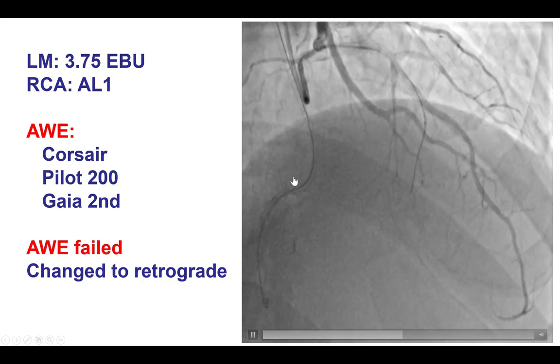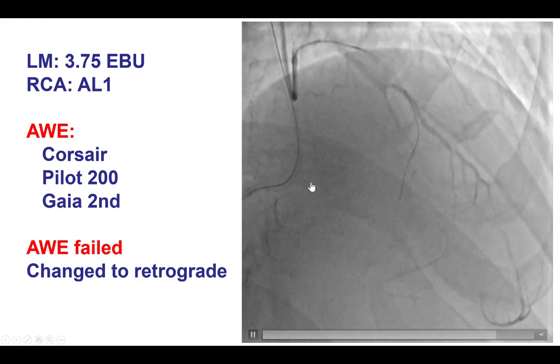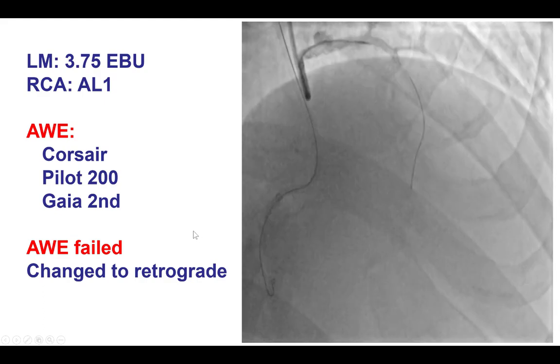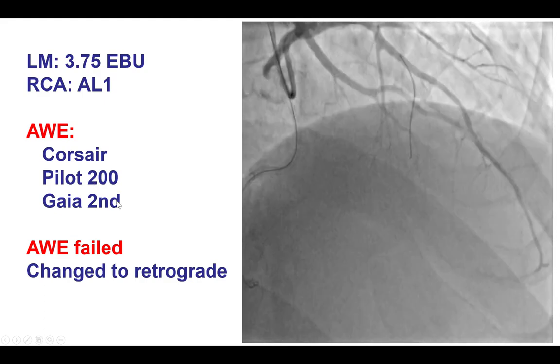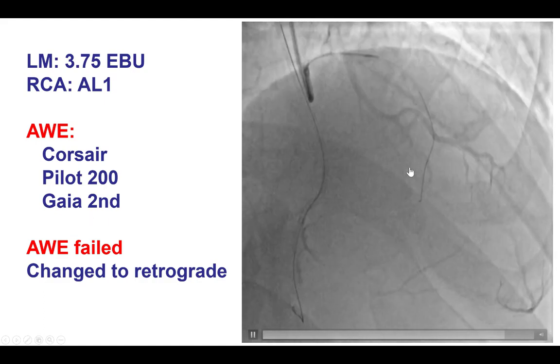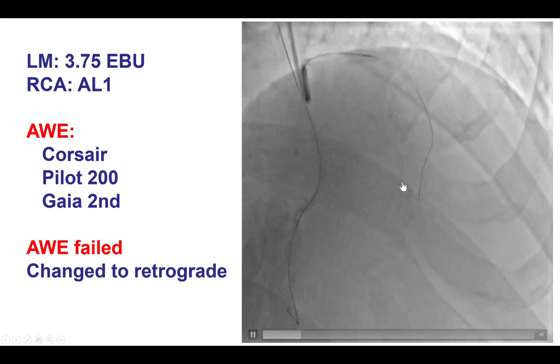Antegrade escalation was done using a Corsair microcatheter and several guide wires such as a Pilot 200 and the Gaia, but it was unsuccessful. That is why retrograde crossing was attempted.